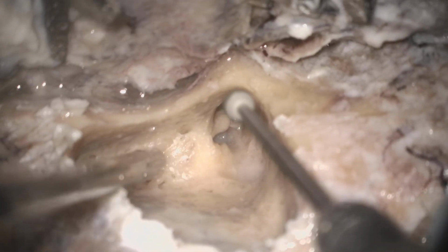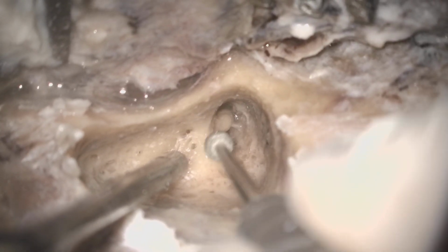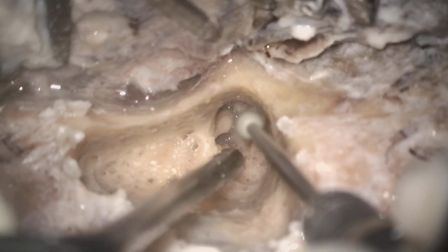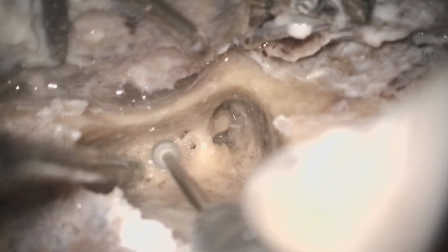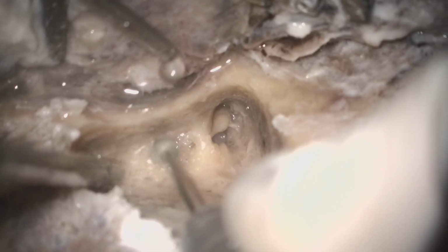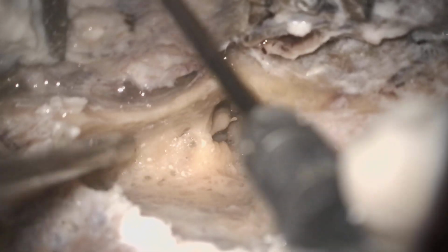Okay. So this is the lateral canal. This will be the incus buttress. The incus buttress is basically kept to protect the incus, the short process of the incus, and secondly, it will hold the electrode after insertion. So in that case, you will have to keep your incus buttress intact for the live surgery.